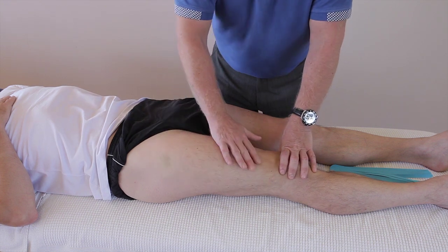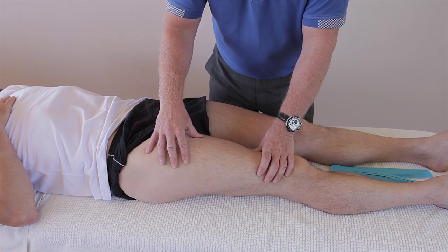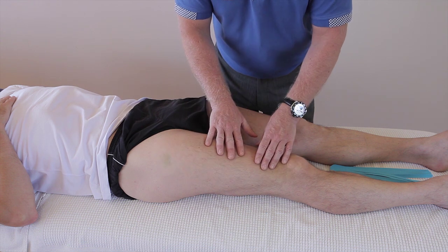So if a patient presents with swelling and bruising into this area, then you can call it a hematoma. As long as there's no obvious bleeding present, then you can apply the kinesiology tape directly over the actual area of pain and swelling.